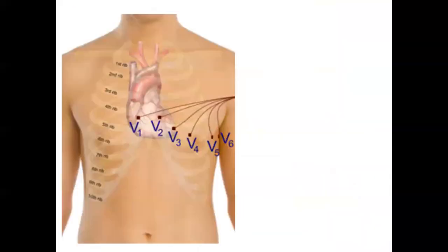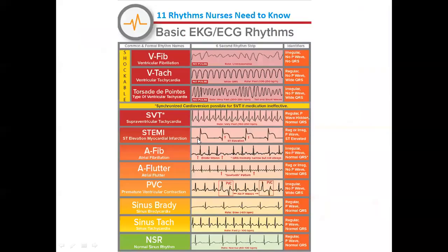Right? So if the EKG monitor in the hospital says asystole, but the patient is clearly active, then we have to recheck it first. And we have to check the lead placement. What is lead placement? It looks like this. This is the lead. We have to check whether they are okay or not okay here.